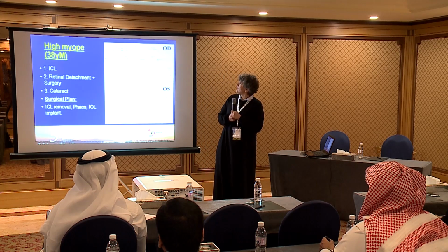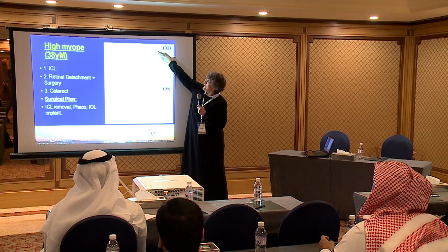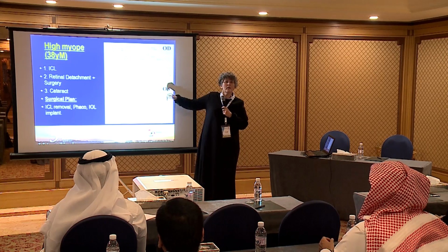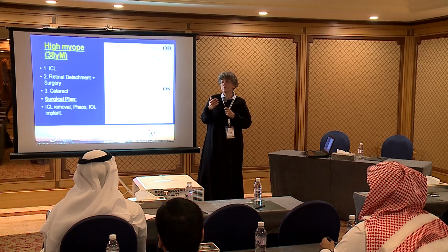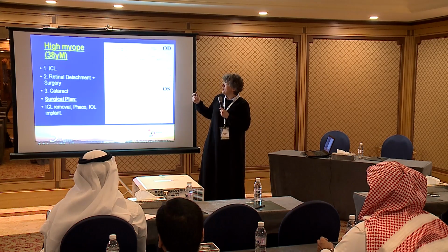So we started measuring him. Here you have to take my word for it, it's a 3.19, and here it's a 2.98. Because of the ICL, the anterior chamber depth is different. Exactly, so you may get a hyperopic result if you go for that.